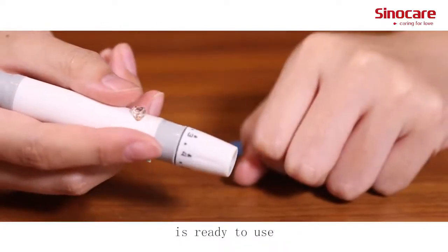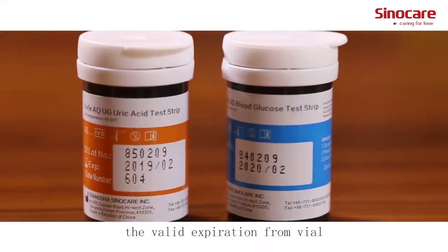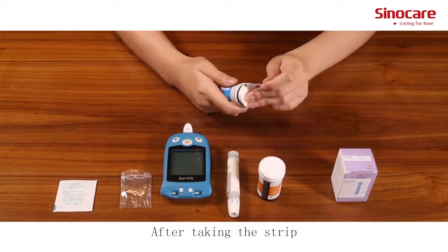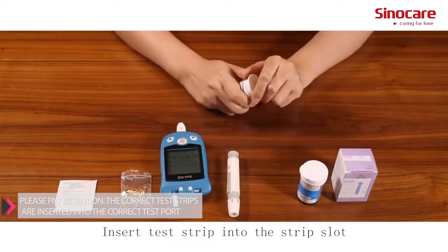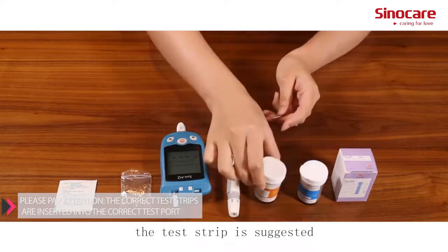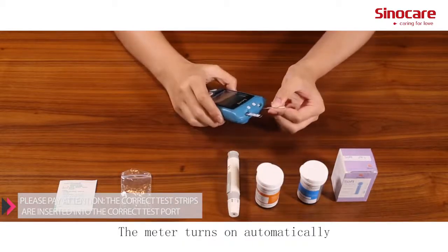The lancing device is now ready to use. Remove a new test strip within the valid expiration date from the vial. After taking the strip, immediately cover the vial to avoid losing efficiency. Insert the test strip into the strip slot. The test strip should be used within three minutes. The meter turns on automatically.